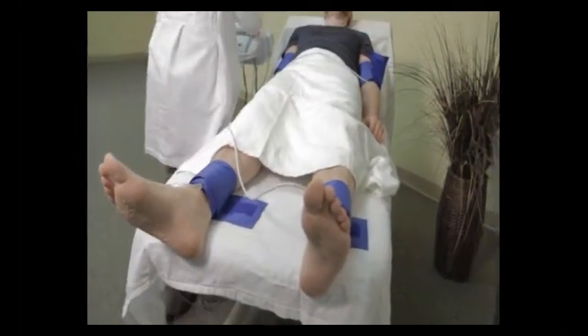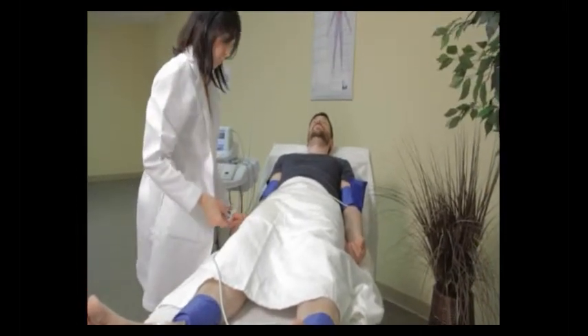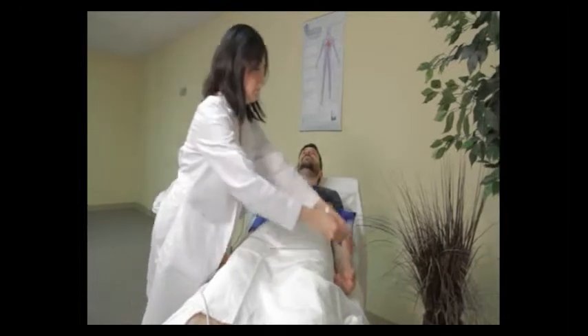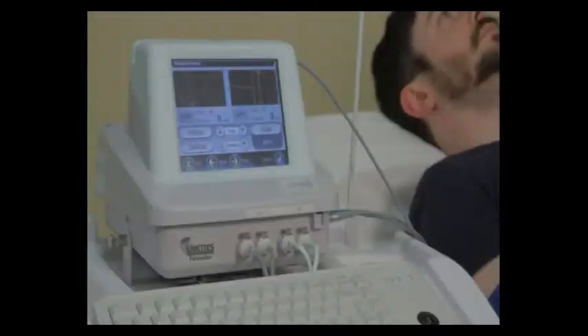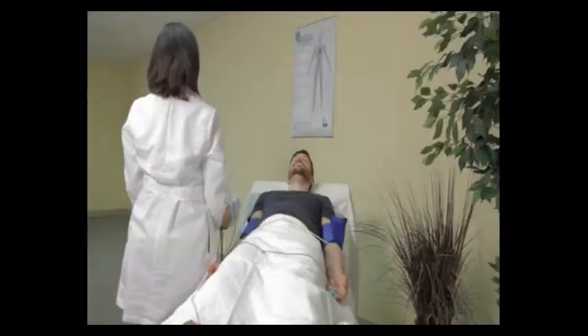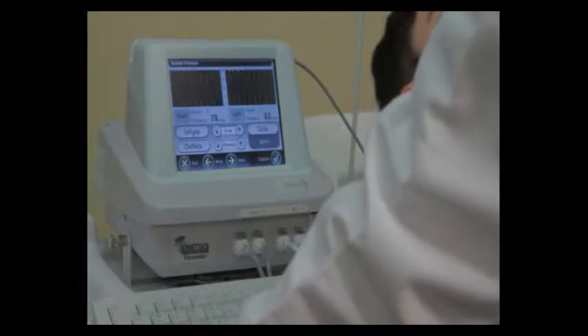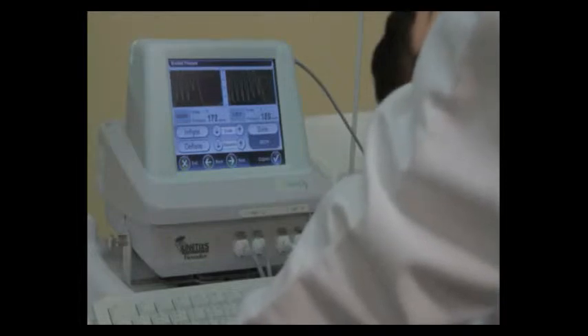She's now going to take the PPG sensors and place them on the patient's fingertips using the first or the middle finger. On the screen, you can see the waveforms. When the pressure in the arm cuffs exceeds the patient's systolic pressure, you'll see a flatline.